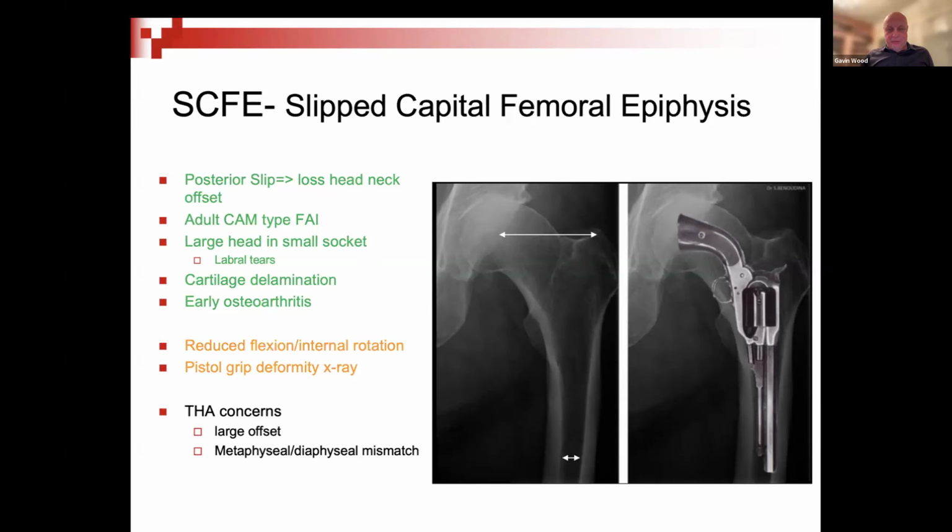However, because they're young adult males, they often have very good thick cortices and you have a very tight, narrow diaphyseal or femoral canal. And when you go up with cementless stems, you go up in offset, but often that small restricted internal diaphyseal canal can restrict you going up in stem size. And so obtaining the large offset required can often be difficult.